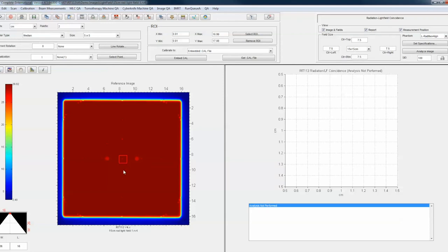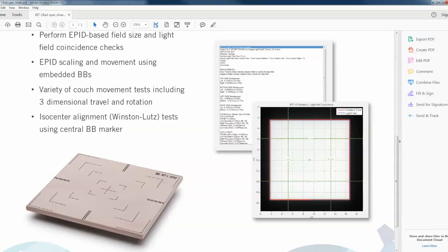If you had an EPID you could put a BB right there at isocenter. We have a little phantom called the LRAD — it's a piece of solid water. If you're using an EPID, this is pretty much the perfect tool. It has a BB embedded at the exact center with laser markings on the four sides, and has the light field scribed for 5, 10, 15, and 20 centimeter fields. You put this on your EPID, set your light field to hit within the scribed areas, expose the field, and the software will work with that. The LRAD phantom is fairly inexpensive.